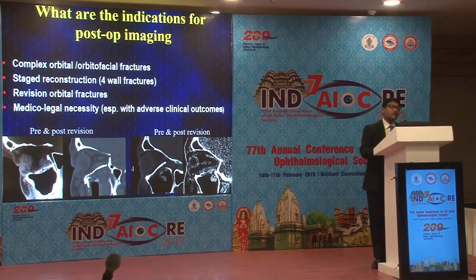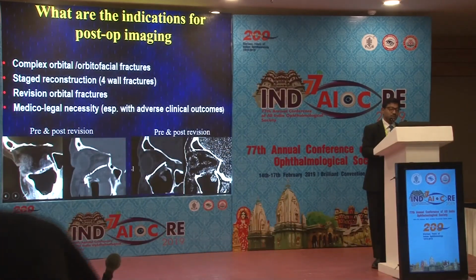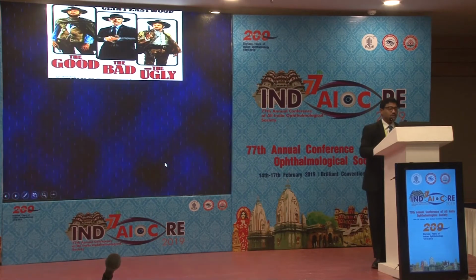And it's now becoming a quality control, so much so that insurance companies now determine, why did you have to go back in? We are not going to cover it for the revision itself, and hence that becomes important. So here's examples of patients where the posterior ledge is over here. The implant is, as you can see, against the posterior wall of maxilla. We have to do a revision surgery, place it along the floor of the orbit itself. Likewise, a bioresorbable implant which has been placed when a previous prefabricated implant is impinging against the inferior rectus itself.